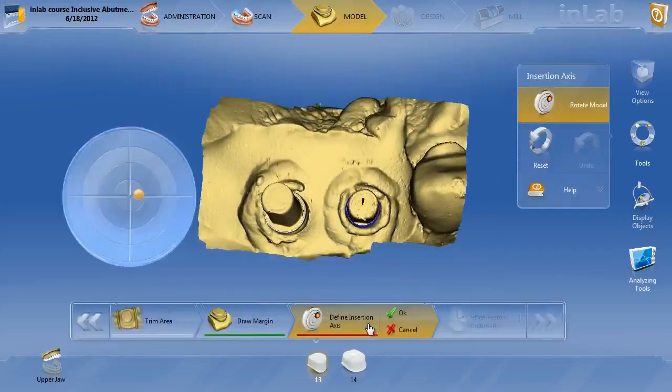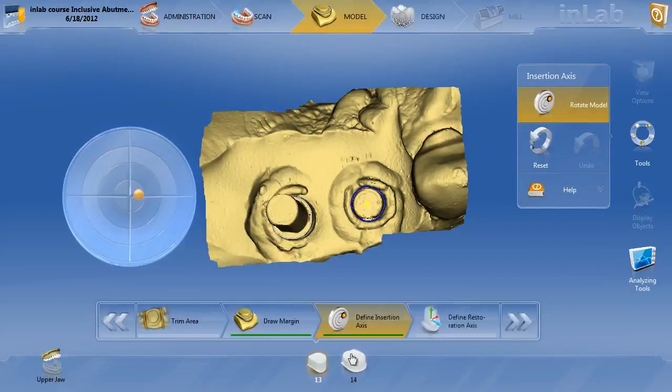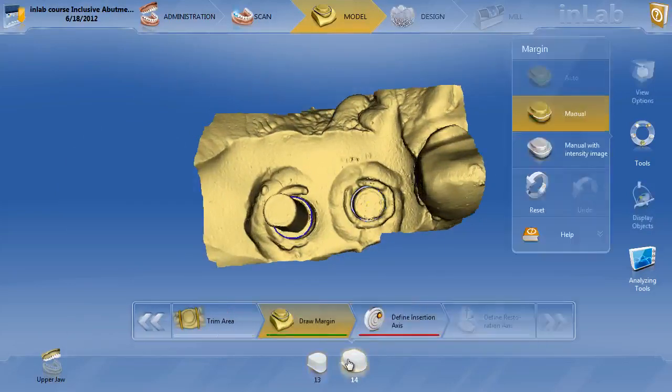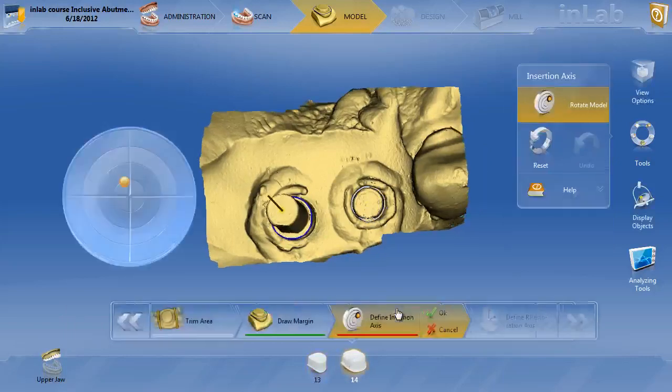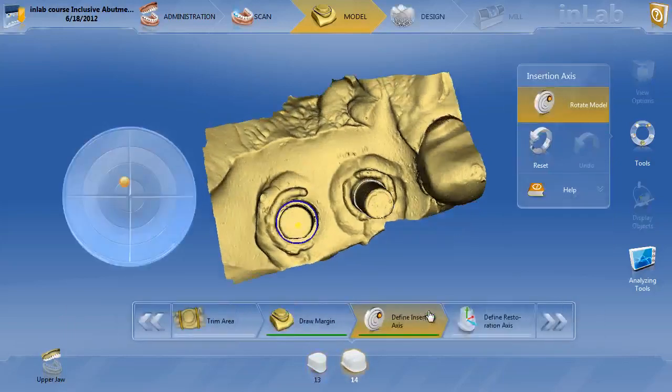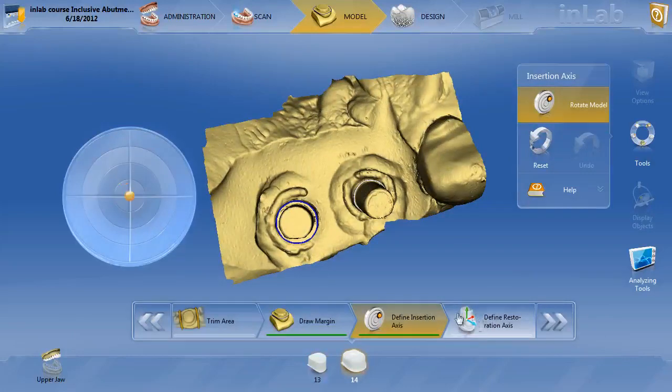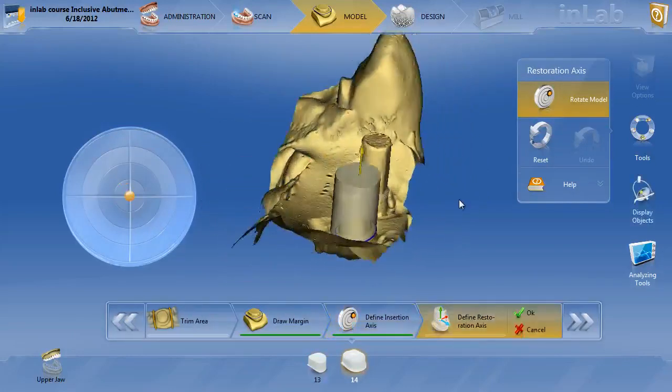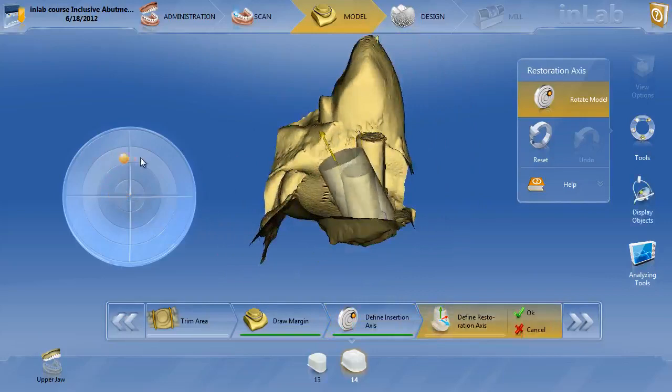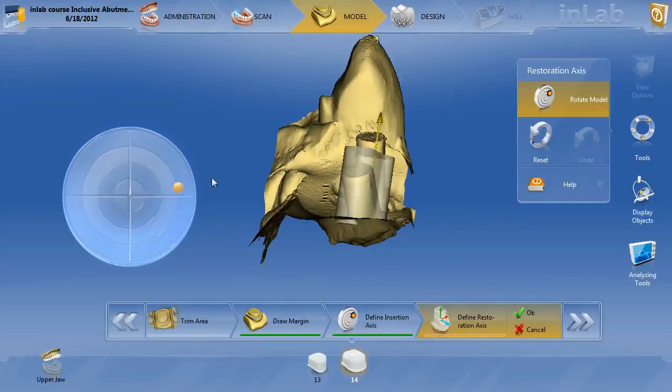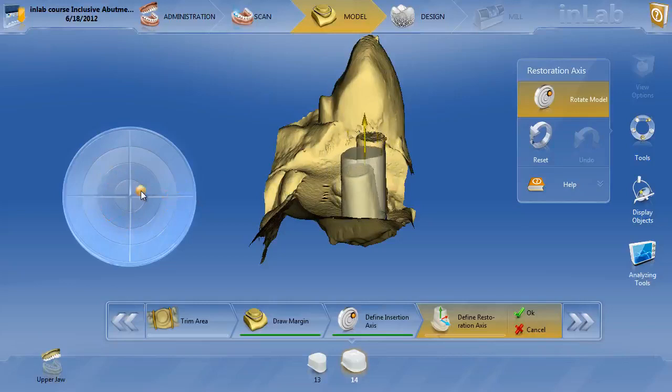Define insertion axis. If you set the model axis right, those should be pretty much accurate right on the button, just on the axis of how they're going to be milled, which they are. Now the important thing is when you define the restoration axis. You can see just like the abutments where you can angle the custom abutment, with telescopes you also have the ability to angle the telescopes. There's no 20 degree rule with the telescopes. You can angle them any direction.